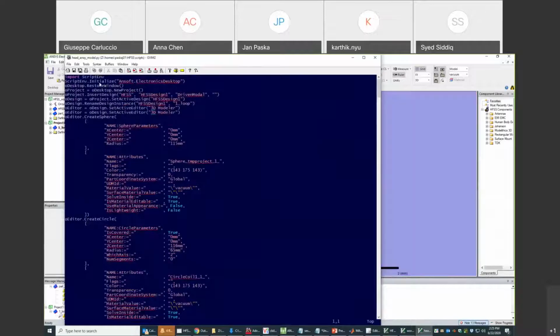So that's the Python file that's running in the background in HFSS. And here are these different commands. It's a little bit intuitive. Here it says create sphere, then you're giving these parameters of the center and the radius.